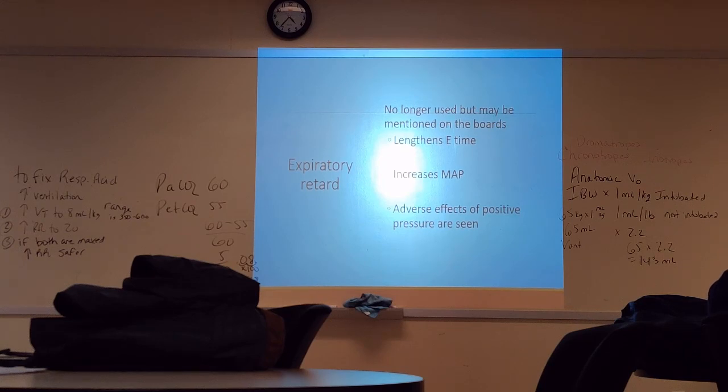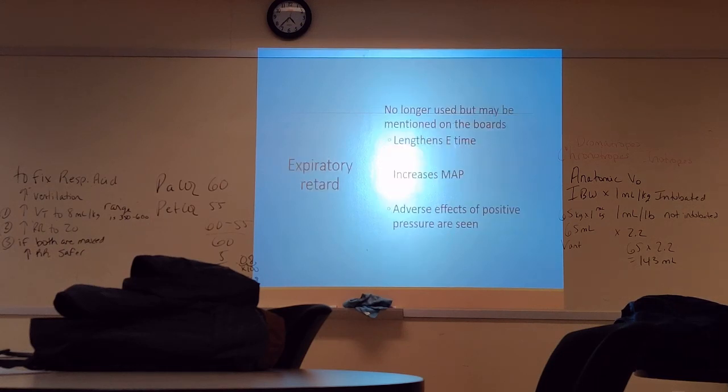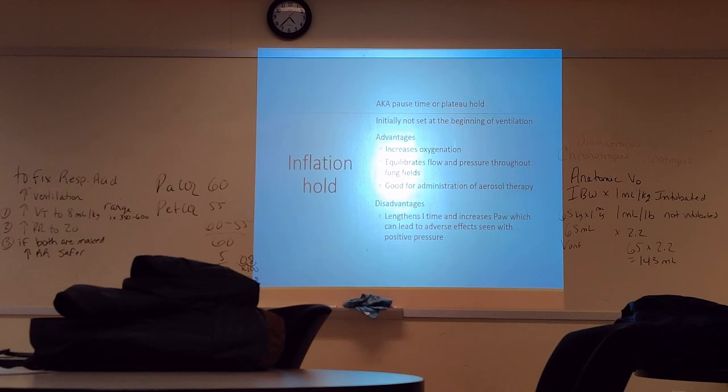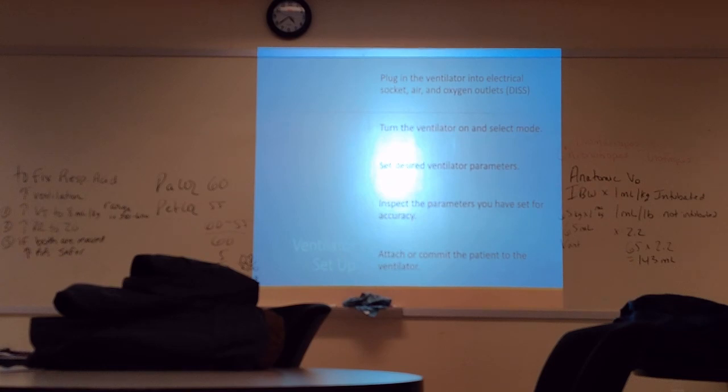So mean airway pressure, so PAW, look, I don't want to change that actually. I don't think this came out of Egan's, right. Fix that. Go back a slide, guys. Right here, where it says PAW, fix that to RAW, resistance of airway. I think that's a typo. I think that came up last class too out of Egan's, and I'm like, that's a way to extend the exhalation time. You're just making the exhalation time longer. It's dumb. We don't do it anymore.